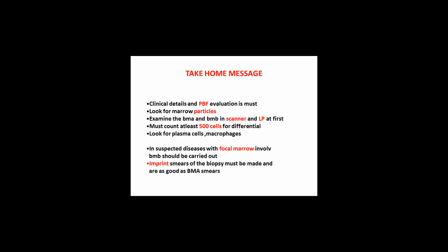Yes, sir. I have also never seen that, because when I learned doing a bone marrow, I also learned it from the sternum. I have must have done more than 5,000 marrows till now, and initially I must have done 1,000 from the sternum, and after that I shifted to the posterior superior iliac spine. It becomes very easy for us, because once a patient is lying straight, even if you cover his head and eyes, you can see the needle going inside his sternum.